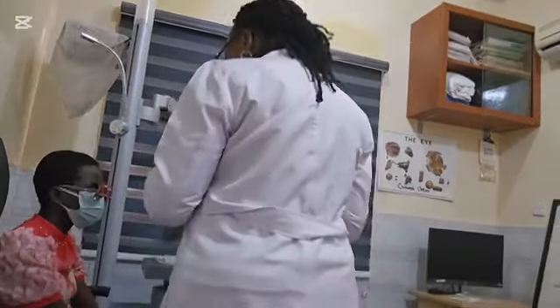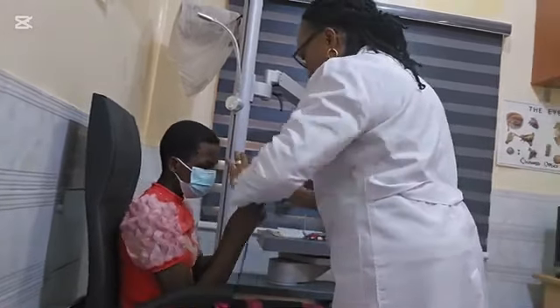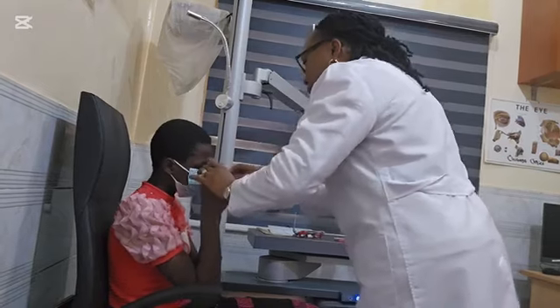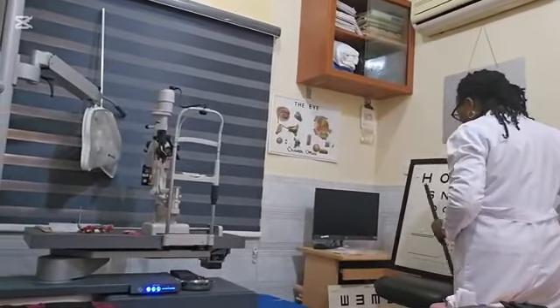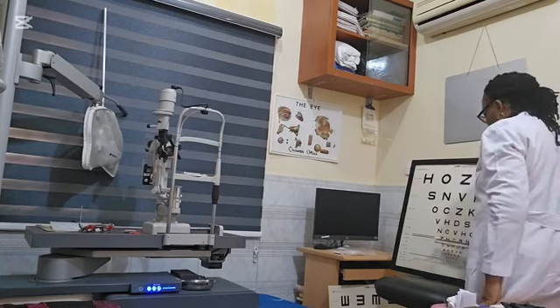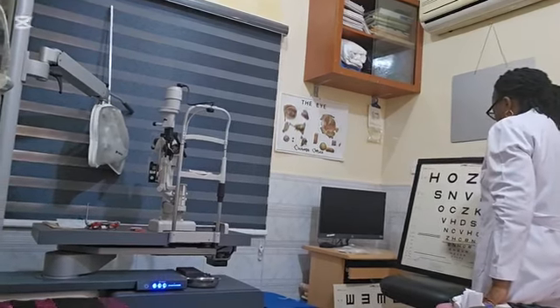Okay, good. So you hold it. Hold it monocularly, good. Let's see what you can read with it. See where I'm pointing at?